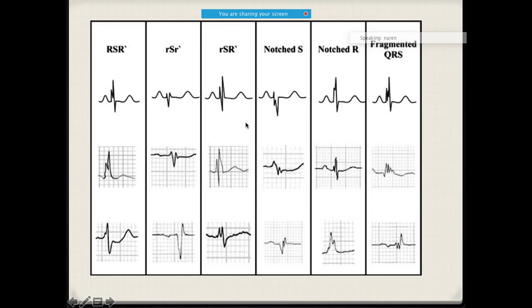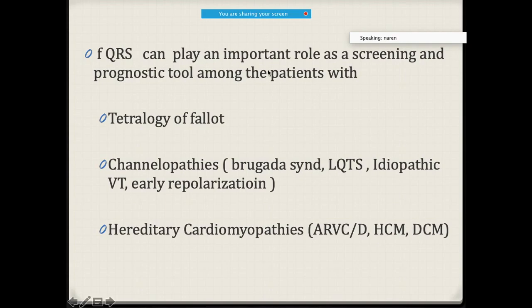A lot of times these patterns may look similar, but remember they are all not the same — they are very much different. That's why, if you are trying to see a patient, you can use fragmented QRS as an effective screening and also prognostic tool. For example, you may come across such ECG changes in patients with tetralogy of Fallot, otherwise channelopathies, or even hereditary cardiomyopathies.